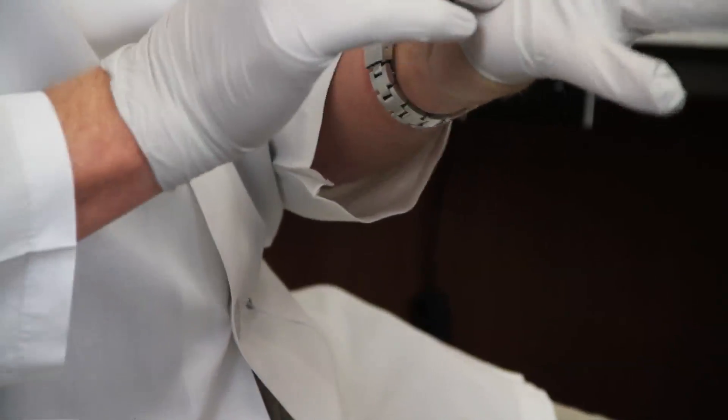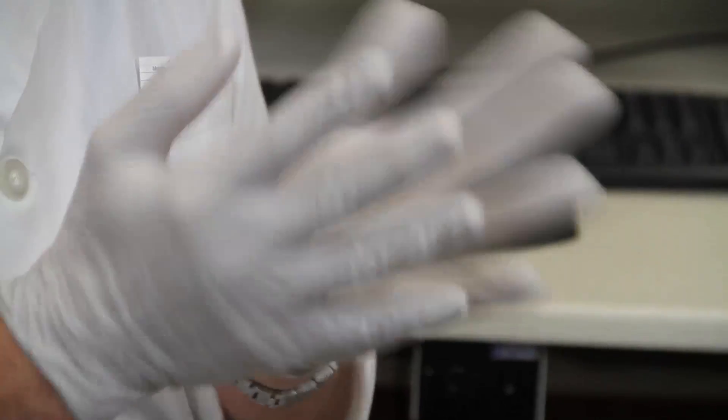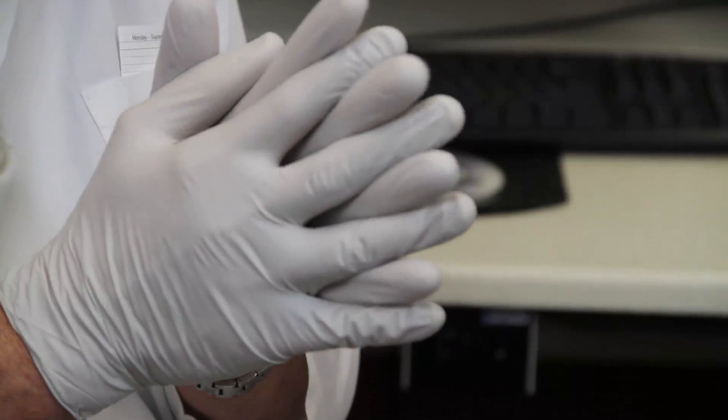Here we are placing our nitrile gloves. Nitrile is a safe material to use — it's not like latex. Mercury can soak through latex. We've tested nitrile, and mercury can't soak through nitrile, so it's safe.